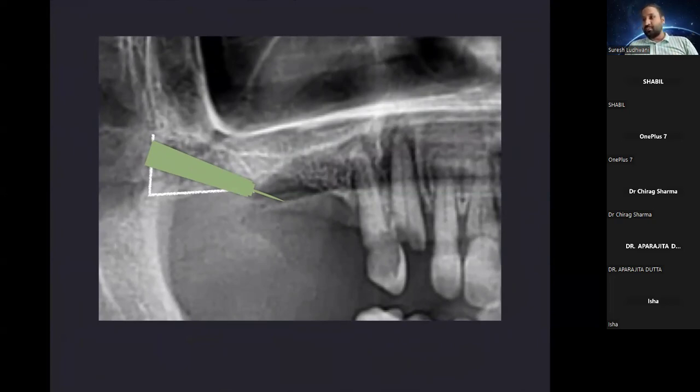It's not like that, because this same implant can still be placed more vertically, because we still have the bone above this placed implant. But I like to stay away from the sinus lining, so I did it, but you can still place it slightly more vertical. Now I want everyone to come back and see the slides.